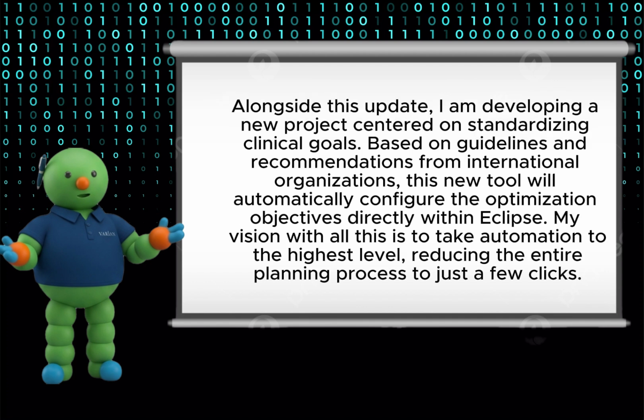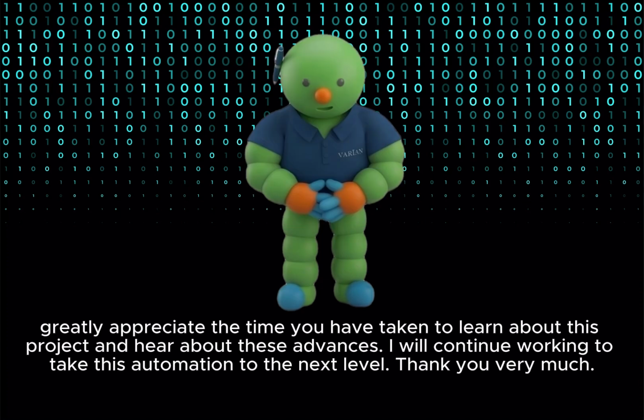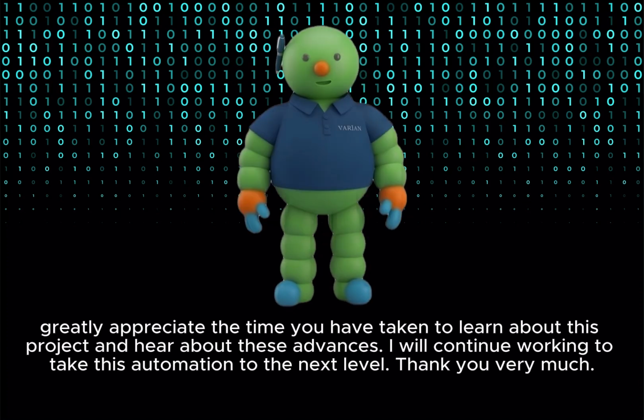Alongside this update, I am developing a new project centered on standardizing clinical goals. Based on guidelines and recommendations from international organizations, this new tool will automatically configure the optimization objectives directly within Eclipse. My vision with all this is to take automation to the highest level, reducing the entire planning process to just a few clicks.